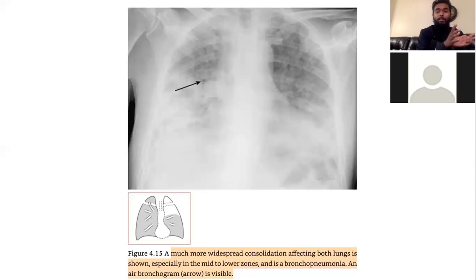Regular pulmonary edema is caused by what? Heart failure, right? Increased hydrostatic pressure. Exactly. So in regular heart failure or pulmonary edema, you know how those blood vessels run in the interalveolar septums, right? So the fluid first accumulates in the interalveolar areas, but if it really increases later on, it gets to that. But in normal pulmonary edema, I'm going to show you, the fluid is just in the interalveolar spaces, not in the alveolar spaces, but amidst the alveolar space.